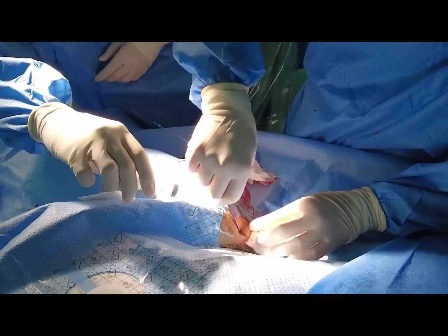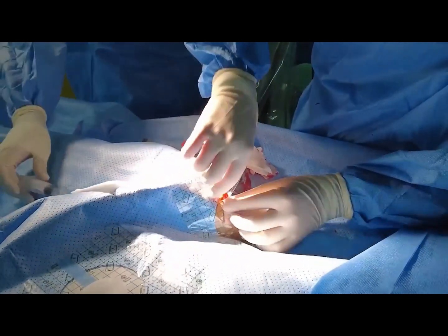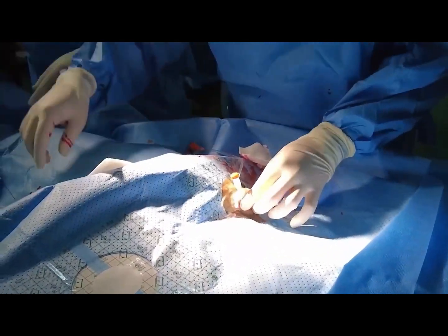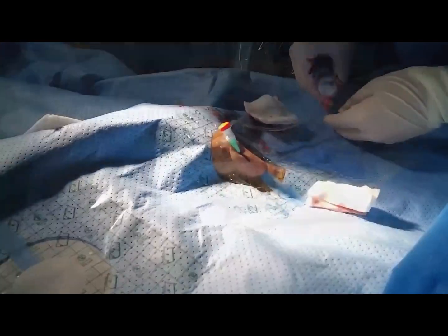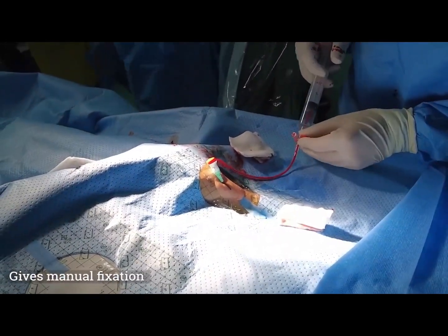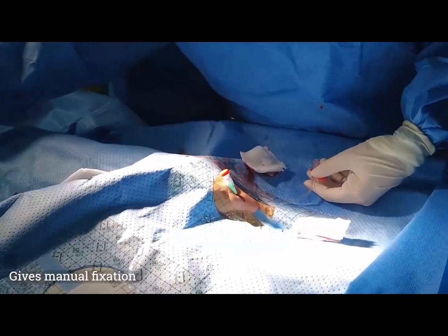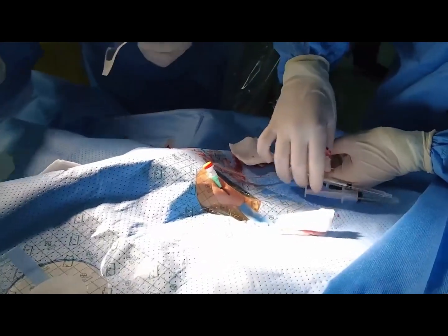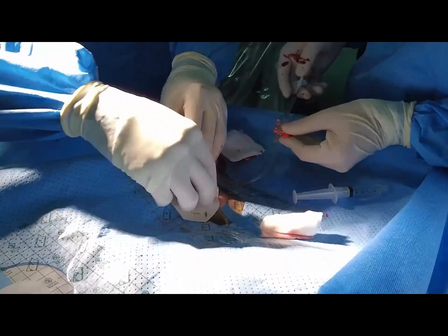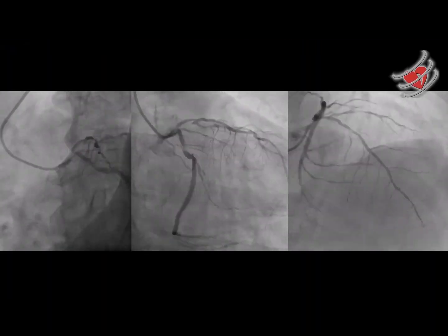In this case, we use a Prelude Ideal 6-7 French, where the outer diameter is 6 French and the inner diameter is 7 French. So it doesn't matter if we use 7 French guiding to do a complex PCI. Because it's very slippery, we give a manual fixation. We take a derm patch as for IV access so that the procedure could be comfortable.